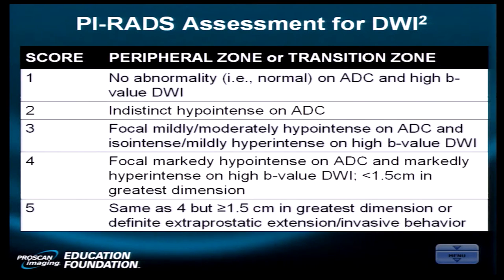But you might say to me, well, what about a scar? Why doesn't a scar versus a tumor, because both of them are going to have desmoplasia, why doesn't a scar give you diffusion restriction? How much water is there in a scar? It doesn't have water in it. So when you have water and desmoplasia together, like you have in a tumor, you get restriction of that water. That's another reason.